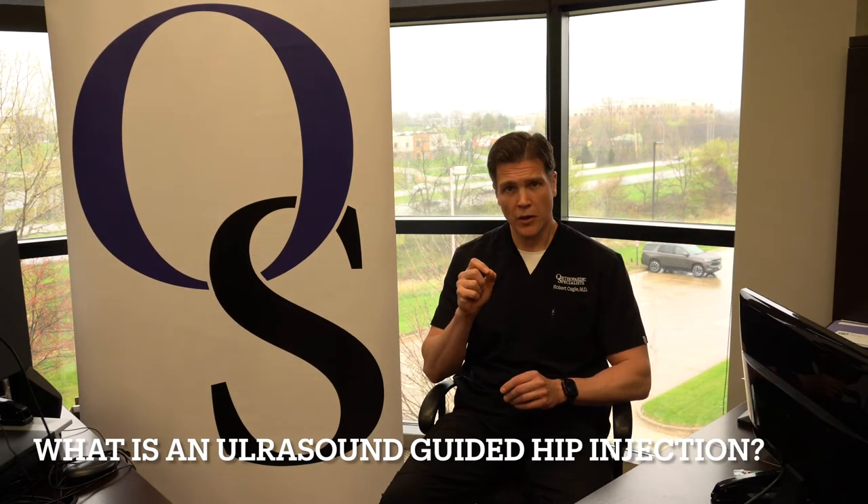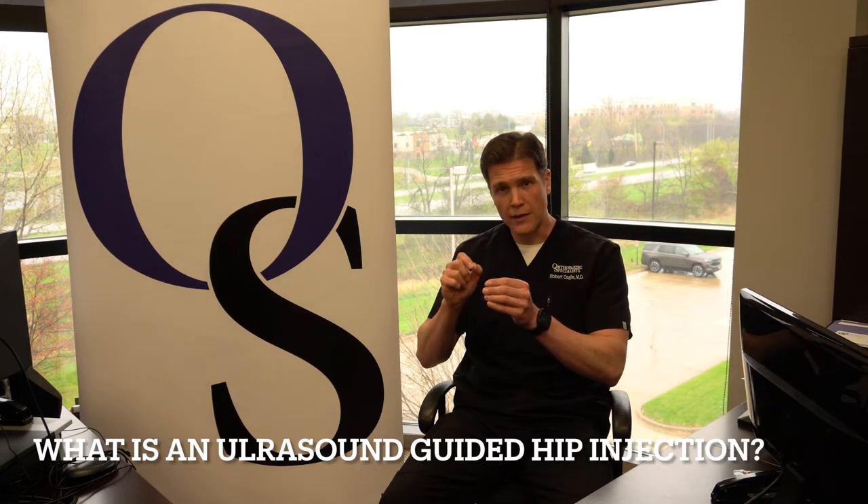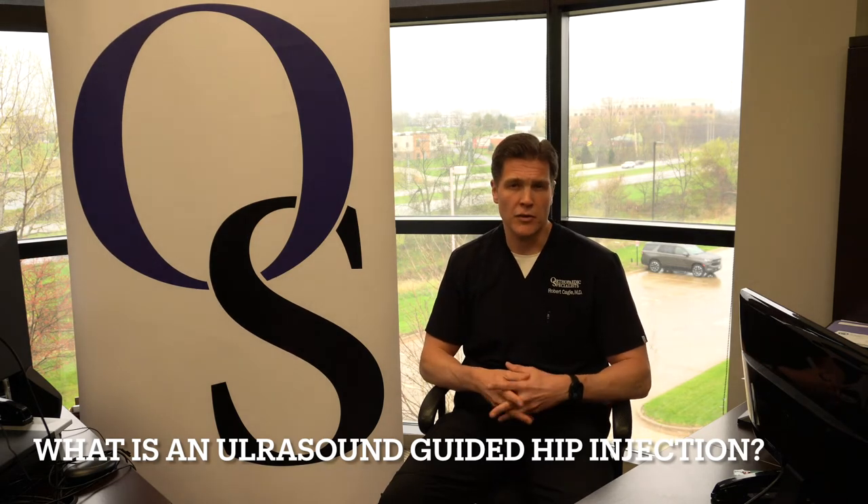So what we use is an ultrasound machine, put it directly over the joint, and use that to direct the needle into the joint to deliver that anti-inflammatory medication to try to give you less pain and let you move on with your lifestyle.